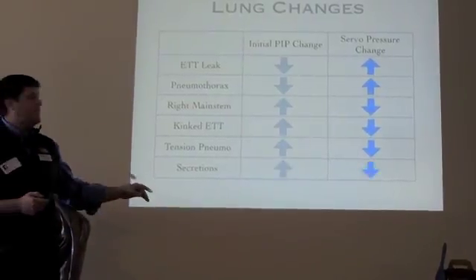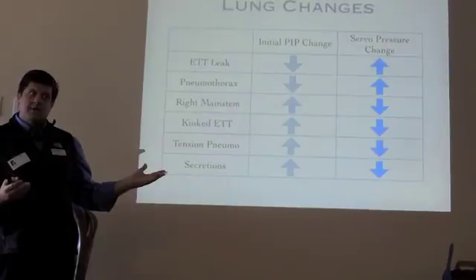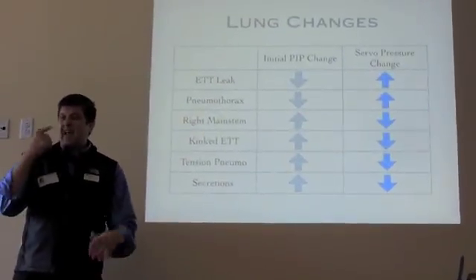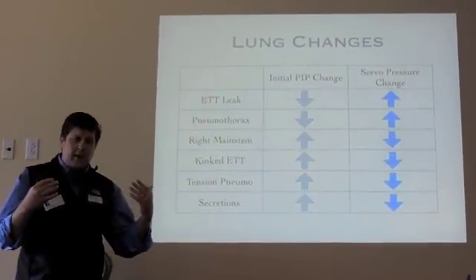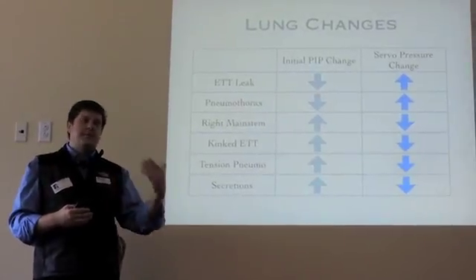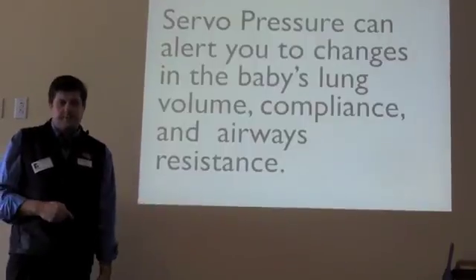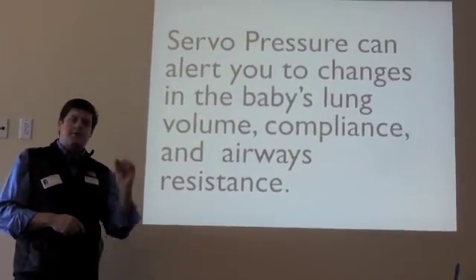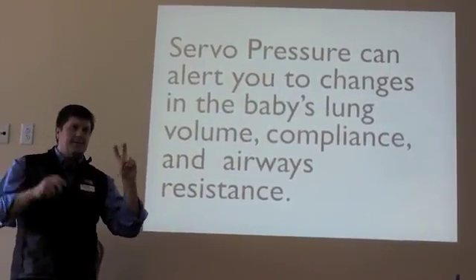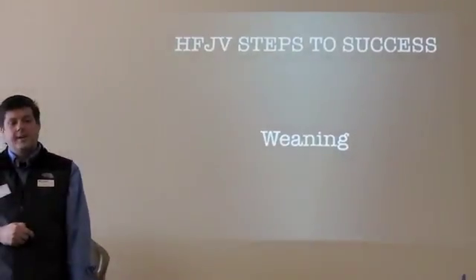But your day-to-day use of this, I think, is with secretions. We always run around asking how often should we suction this kid, and that type of stuff. Well, let the servo pressure tell you. If the sats are dropping and we're trying to decide whether it's worth suctioning or not, look at the servo. If it's a little bit less than it was before, then it's probably worth going down and suctioning. And so trending that servo pressure, going up and going down, and what his normal baseline is, is a really big clue to tell you what's going on with the kid.